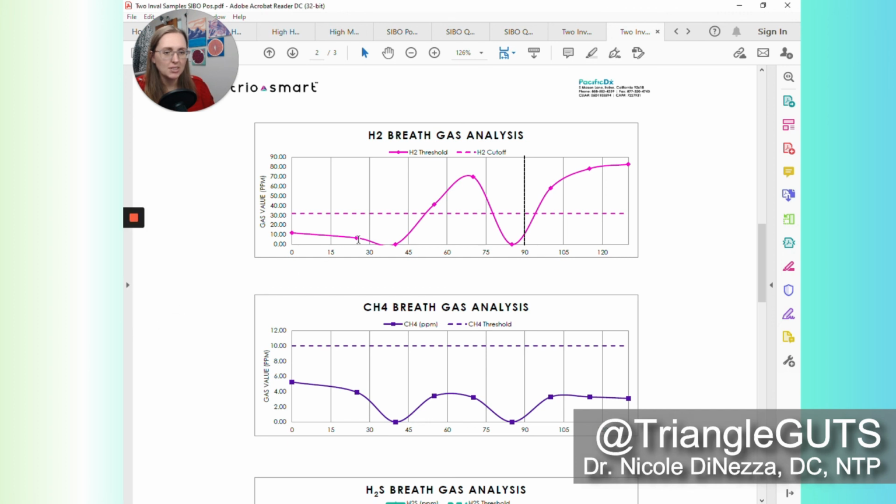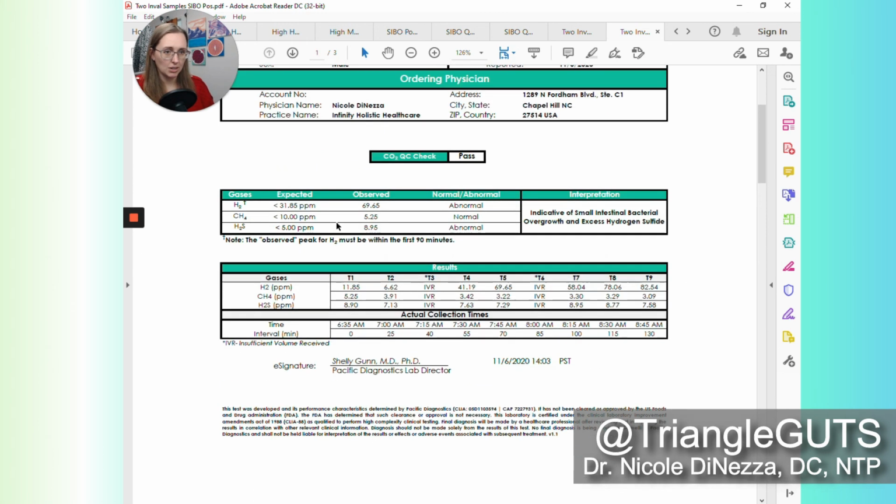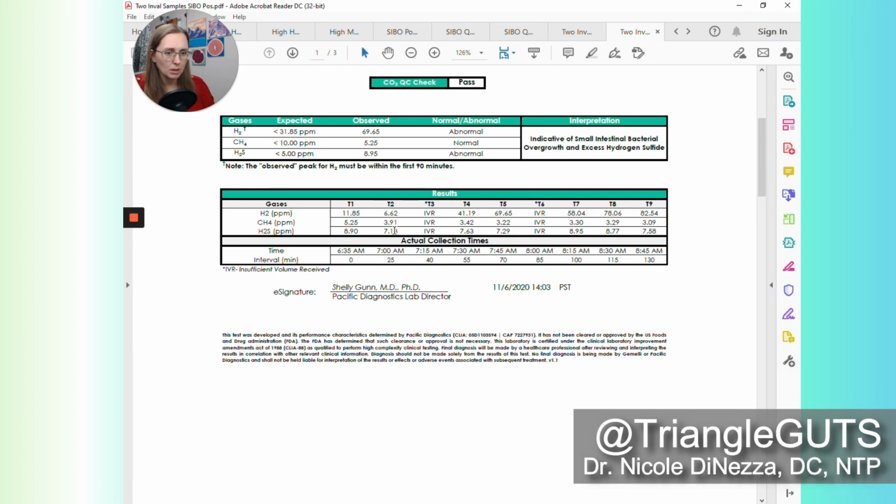So let's compare the difference between sample number 2 and sample number 4. I think that's going to tell us what we want to know. All right, sample number 2 goes up to 6.62, and then this person climbs up to a whopping 41.19. And this is in the territory where I would still consider it a possibility that we're looking at small intestine fermentation. It's right before the 60-minute mark, and there have been studies that lactulose can speed up transit profoundly.